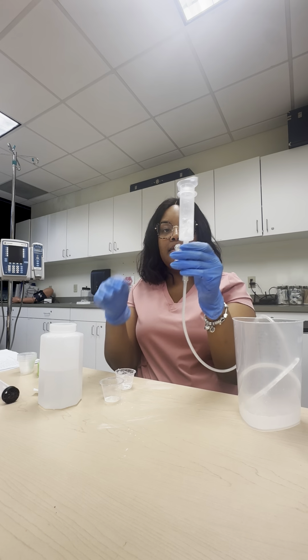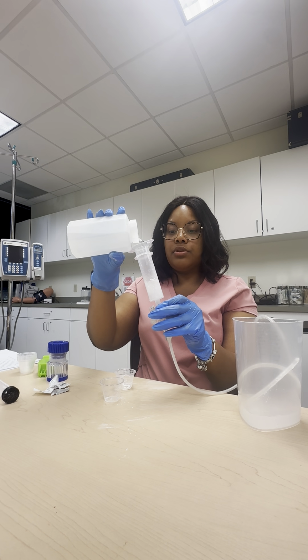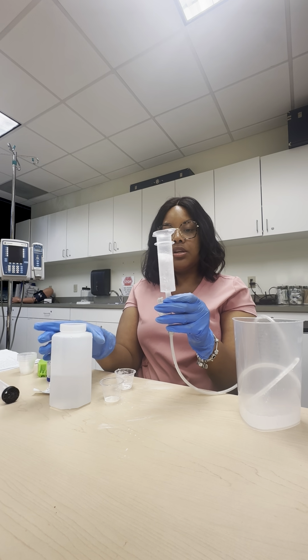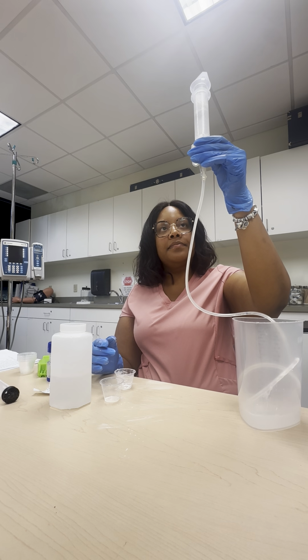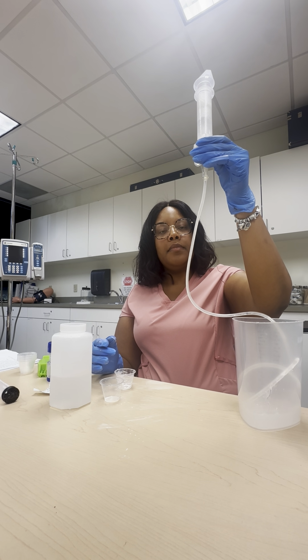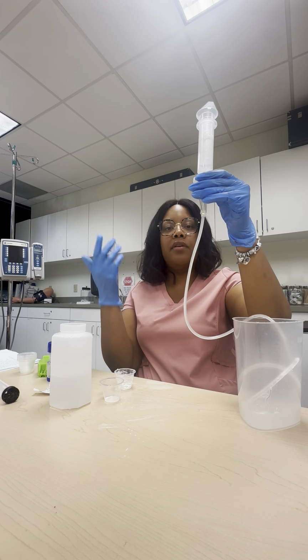All right, so we got some little residues around here. We're just going to do the same thing to make sure the patient gets all their medicine. So lift it up. That wasn't our flush, that was just getting the residue off the side.